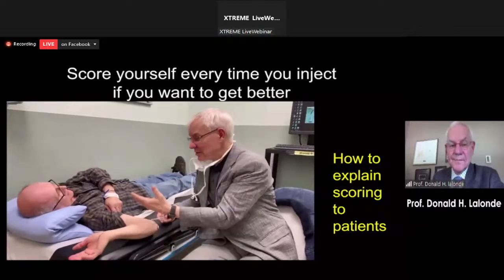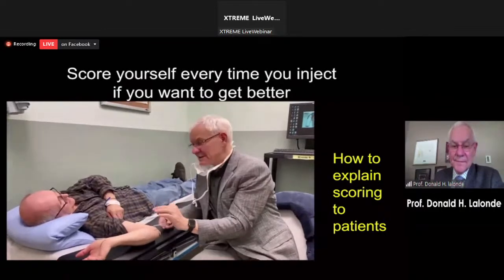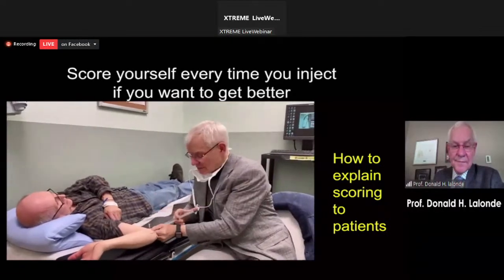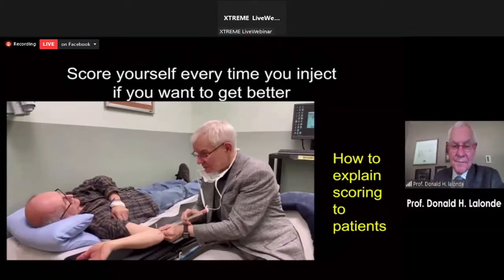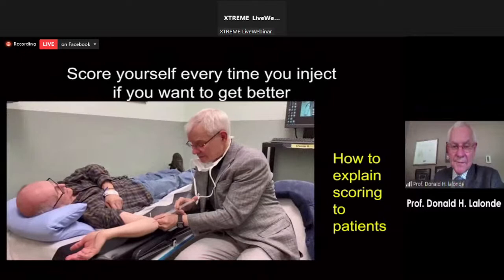So you're gonna feel the first little poke probably when I put the freezing in. But after that, I want you to tell me when the first sting is gone. And every time after that, I want you to tell me if you feel any more pain, because I don't know if you don't tell me. So you're gonna feel this first little poke here. At the count of three, I want you to try not to move. At the count of two, I want you to take a nice deep breath. Can you do that for me? So you're gonna pinch three times. One, deep breath, don't move. Great. Thank you so much for not moving.